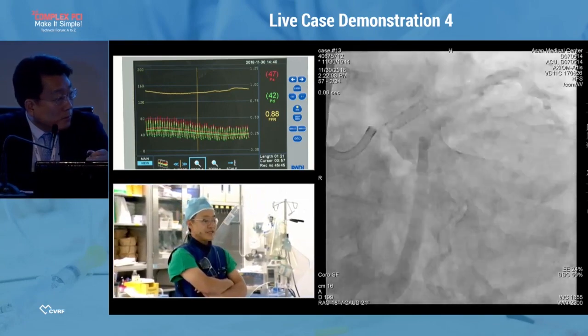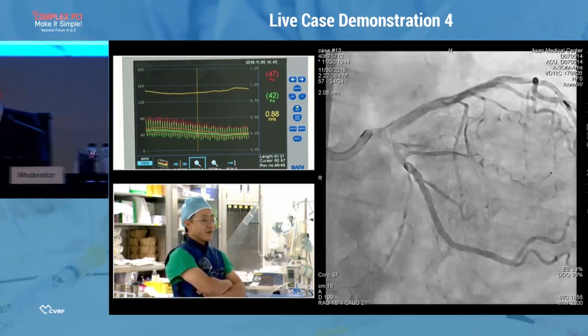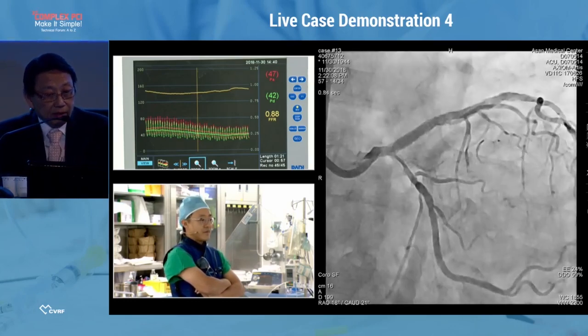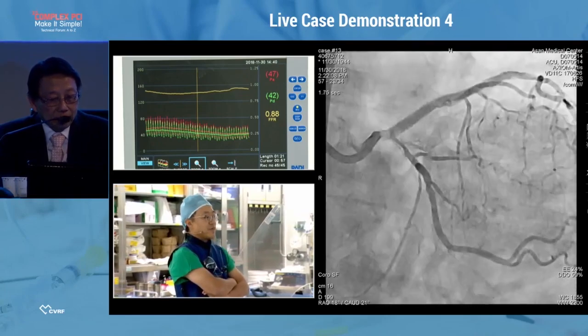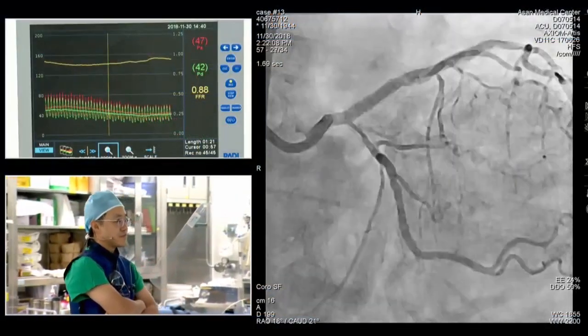Dr. Duk-Woo, yes, I have a question. If we look at the data from the DEFER trial, 15 years follow-up, we can safely defer a lesion if the FFR is above the cutoff they used of 0.75, until 15 years. But I'm just wondering whether this holds true also for in-stent restenosis. Here, of course, the FFR is quite acceptable, but this is a case with in-stent restenosis. We don't have solid data about that. However, I think it's not too different from native artery stenosis. And an FFR of 0.9 means absolutely no MACE during the 5 years, 10 years data.